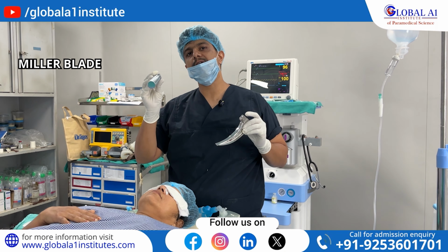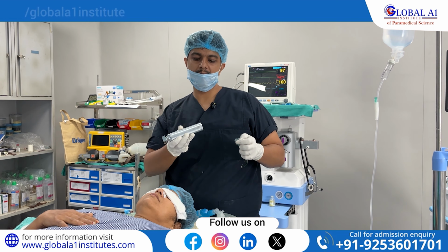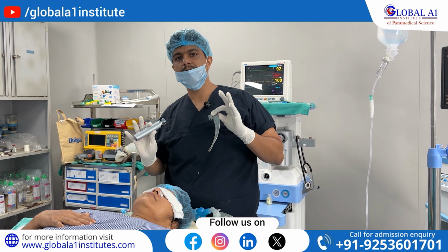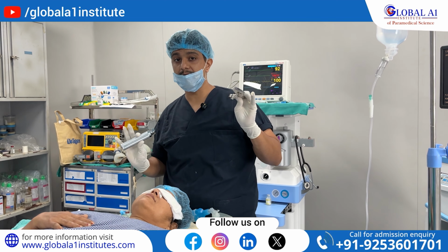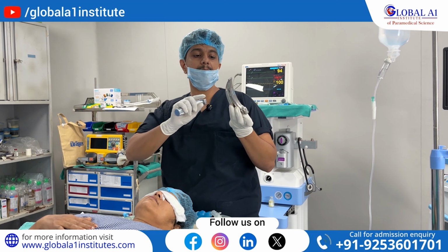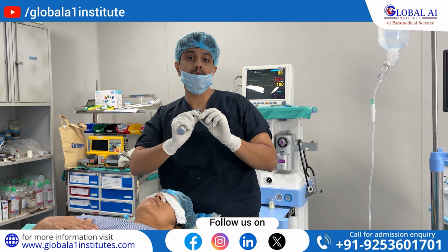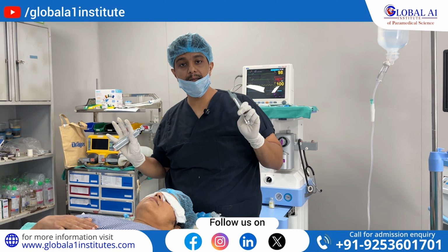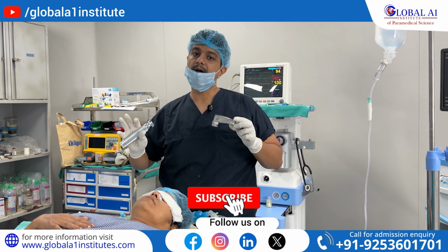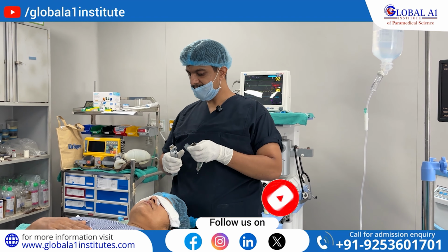And the handle of the scope is very small. In this case it is very sturdy, as you can see. In that case it is very sleek, elongated, so that intubation is done easily, right? It is an important step for an anesthetist or the person who is intubating. The main thing is that the bulb fitted in this has to be checked thoroughly, that it is screwed well into the scope. Otherwise you will land in a big problem, like this thing can fall into the trachea while intubating the patient, right? So we are starting with the GA and the steps will follow. Thank you.